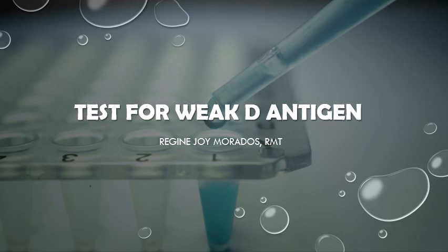You have a patient that needs blood for transfusion but doesn't know his blood type. The phlebotomist took a sample from the patient and gave the sample to you. After doing the forward and reverse grouping, the reaction of the anti-D was negative. What will you do next? Will you release the result as Rh negative?